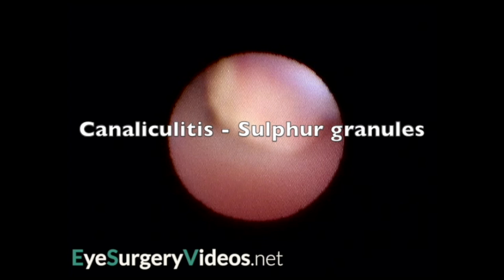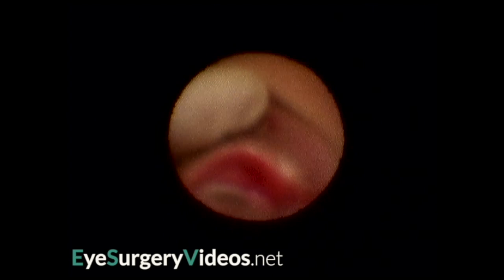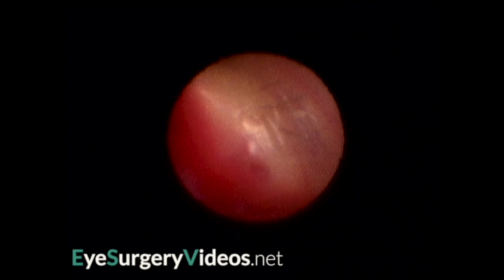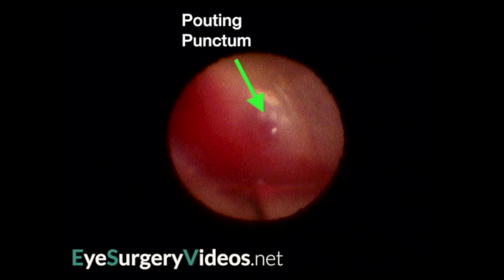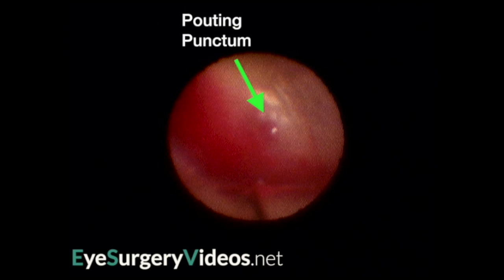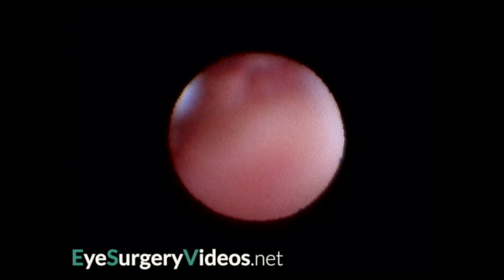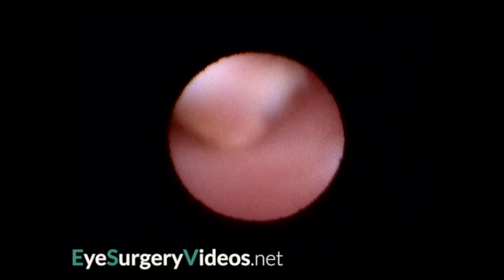Dacryoendoscopy is increasingly widely used for the diagnosis and treatment of lacrimal drainage disorders. Here it provides clear views into the canaliculus of a patient with Actinomyces canaliculitis, and allows confirmation that all the material has been removed.